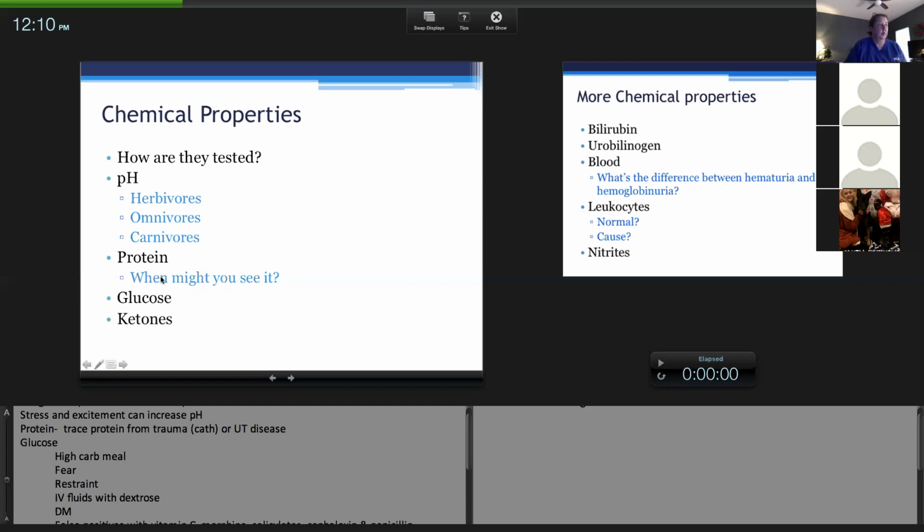Now, I talked about protein. Normally you usually want negative protein or trace protein. But if there's a high amount of cells in the urine, like if we have a urinary tract infection, cells in the urine will trigger protein on the dipstick. And also sometimes if an animal's on a high protein diet, or if they have high blood pressure. So we don't normally want to find protein in a urine, but if we do, then we've got to kind of follow a path to figure out why there is protein, which is called proteinuria.